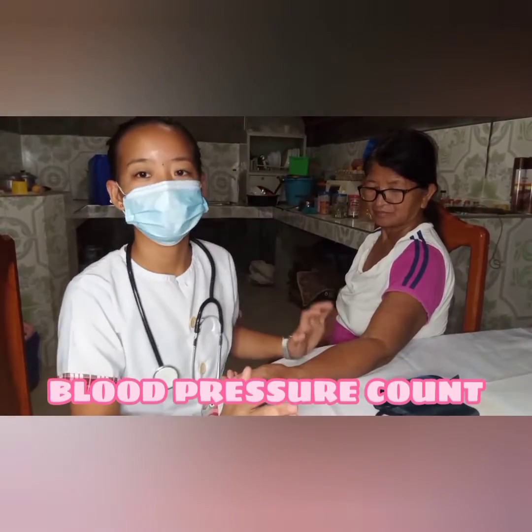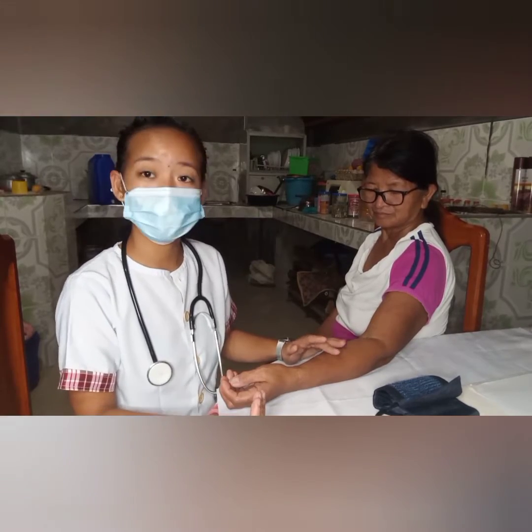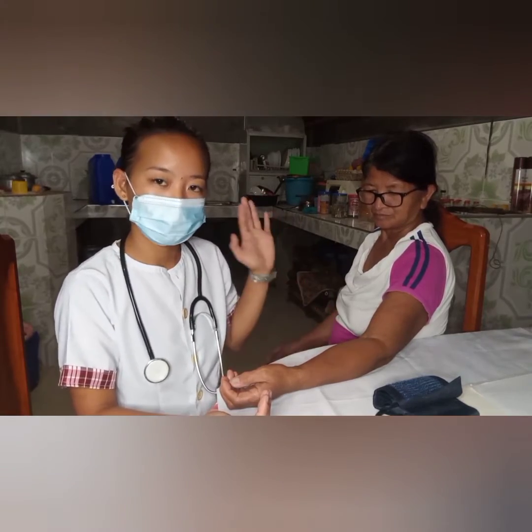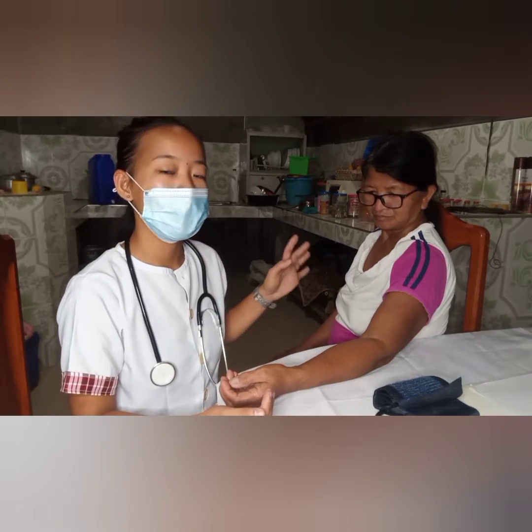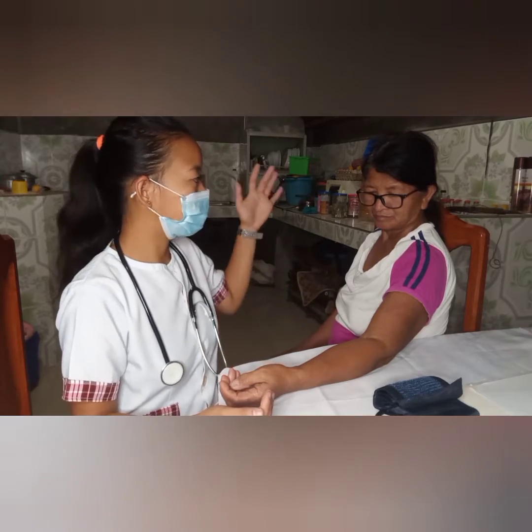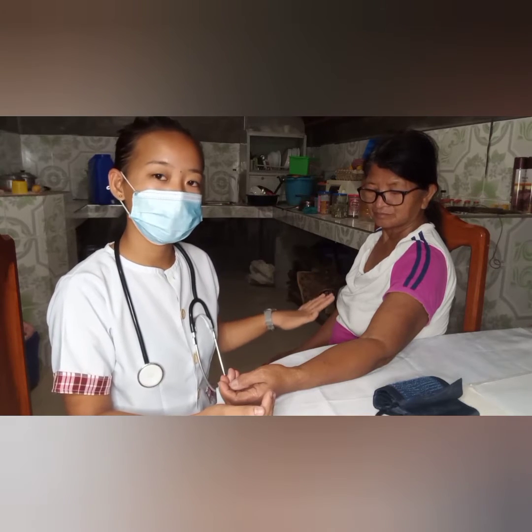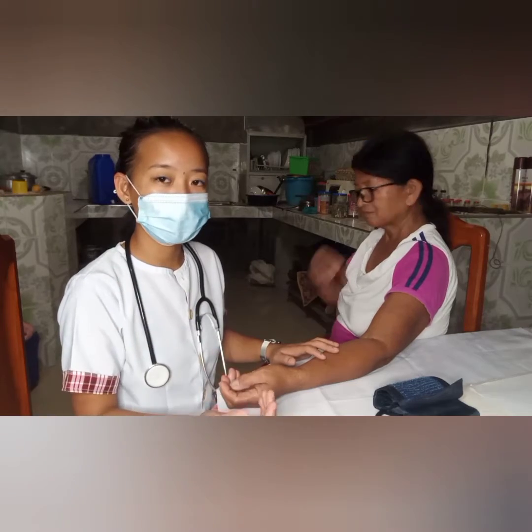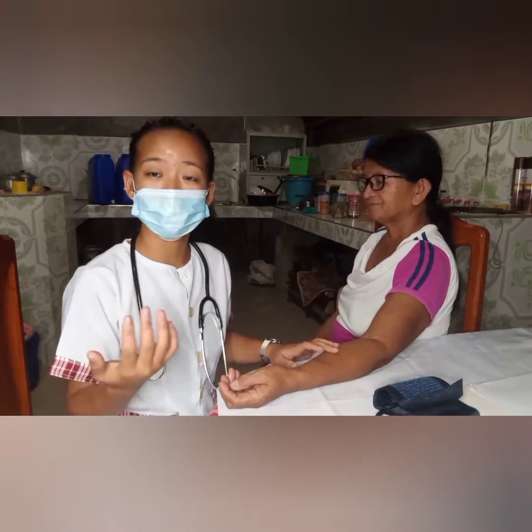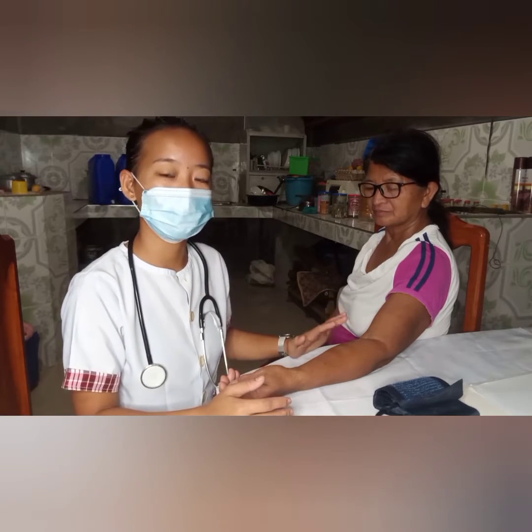Okay, let us now proceed on getting the blood pressure of the patient. On getting the blood pressure, we have to remember a lot of things, and this includes the sitting position of the patient. She must be sitting properly and not lying down. And of course, we have to observe if she is in good condition, if she is relaxed. Otherwise, if she is exaggerated or showing too much high emotion, we have to allow her to stay calm first.